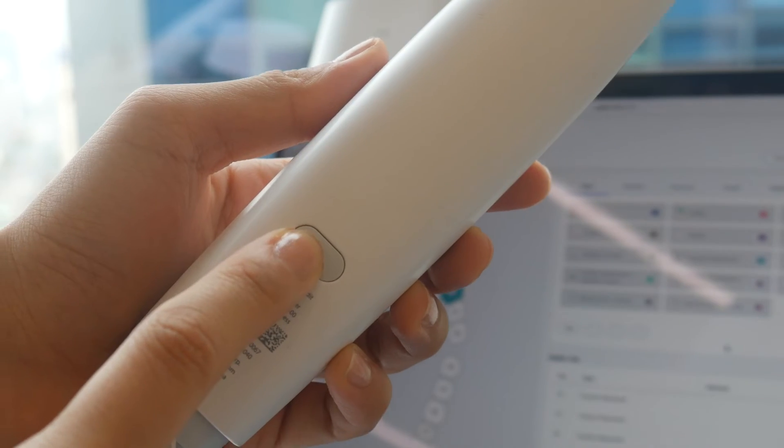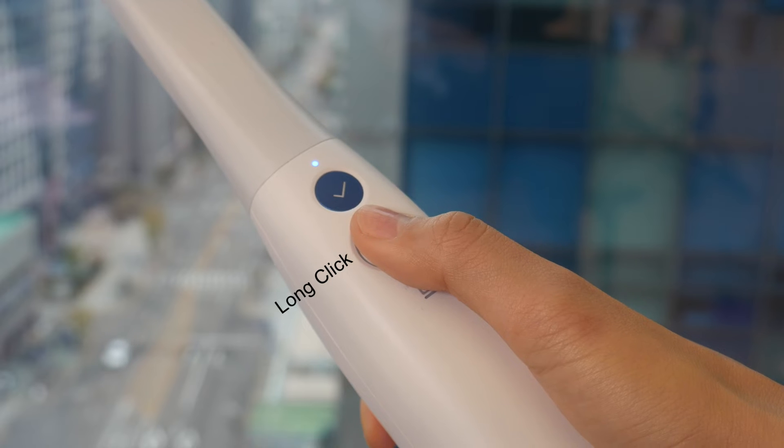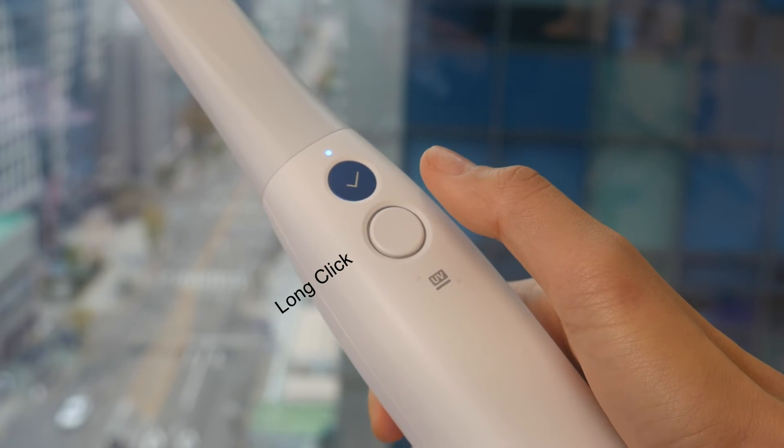Make sure that both your scanner and the hub with which you want to connect are turned on. Hold down the control button for more than two seconds. The scanner will briefly vibrate three times, which means you're ready to start using switch and scan.